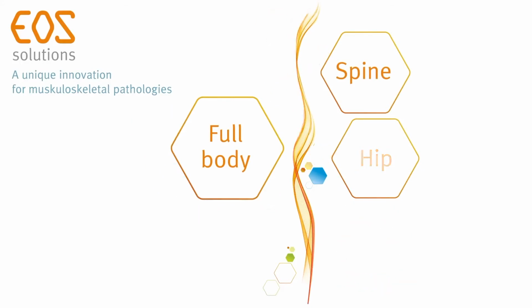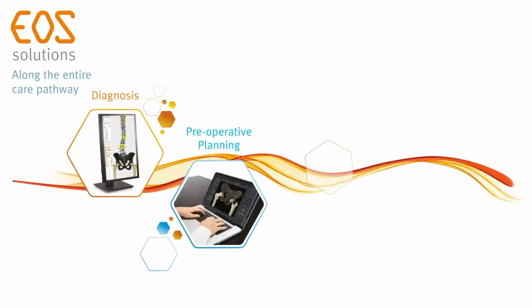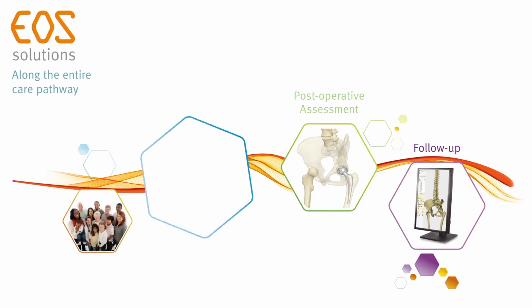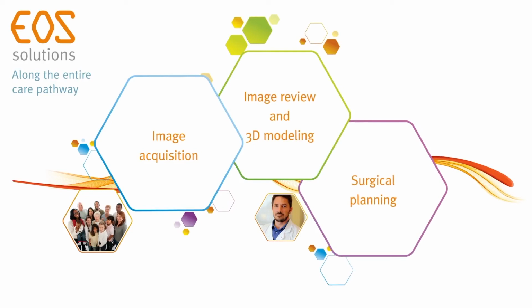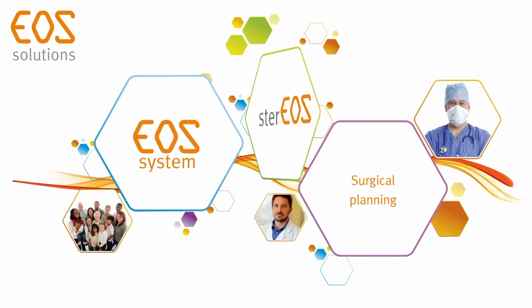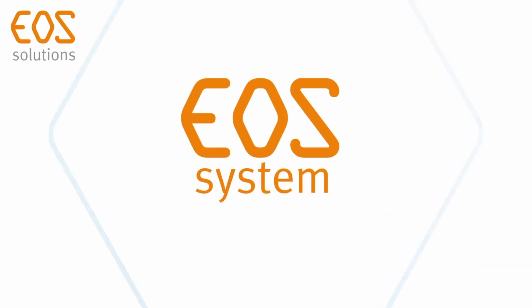From a patient advocacy standpoint, they love it. It's less radiation. It's faster. The images are great, so the physicians love it. So we've been happy to utilize it. We want to be the premier provider in our region, and we want to give patients the best service. And so we discern that this is the best option for diagnosis for a lot of ortho musculoskeletal ailments. It's a multifaceted decision, and we decided it was important to us to give this solution to our patients.